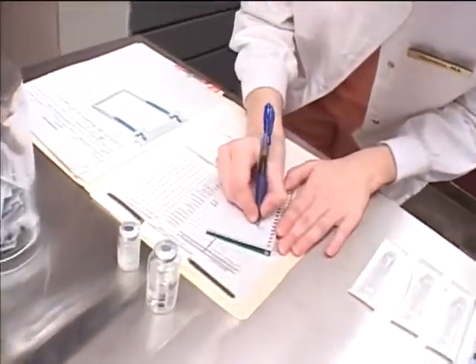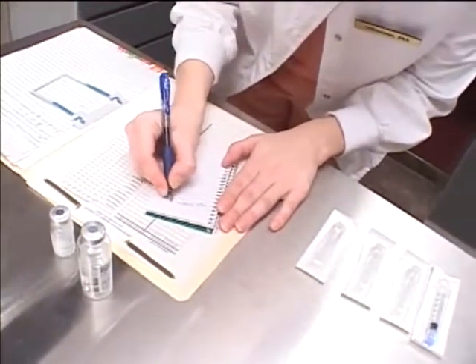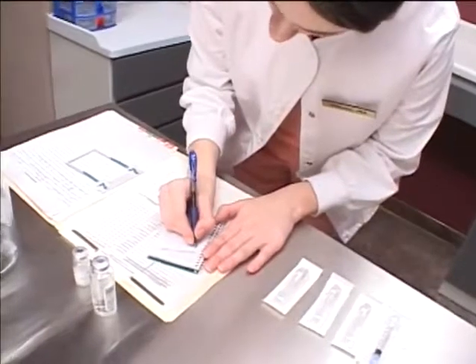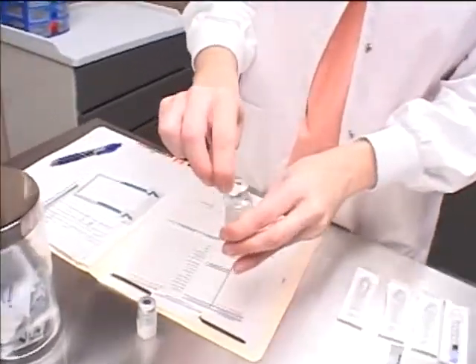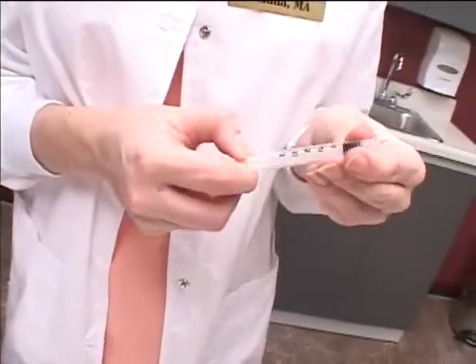Calculate the dosages for each medication order. Add both dosages together. This will determine how far you pull the plunger back when withdrawing medication from the second vial. Swab the top of each vial with alcohol. Open the syringe and loosen the barrel.